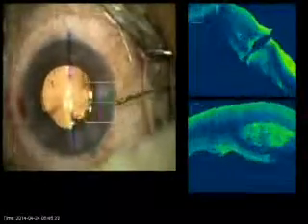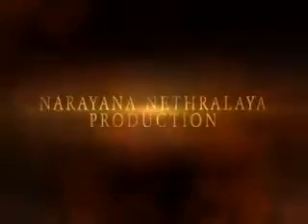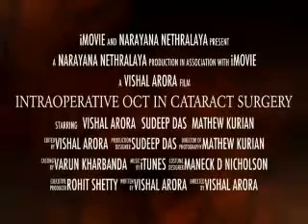Intraoperative OCT gave us new insights into cataract surgery. This novel technology can be used both as a research and teaching tool for ophthalmologists.